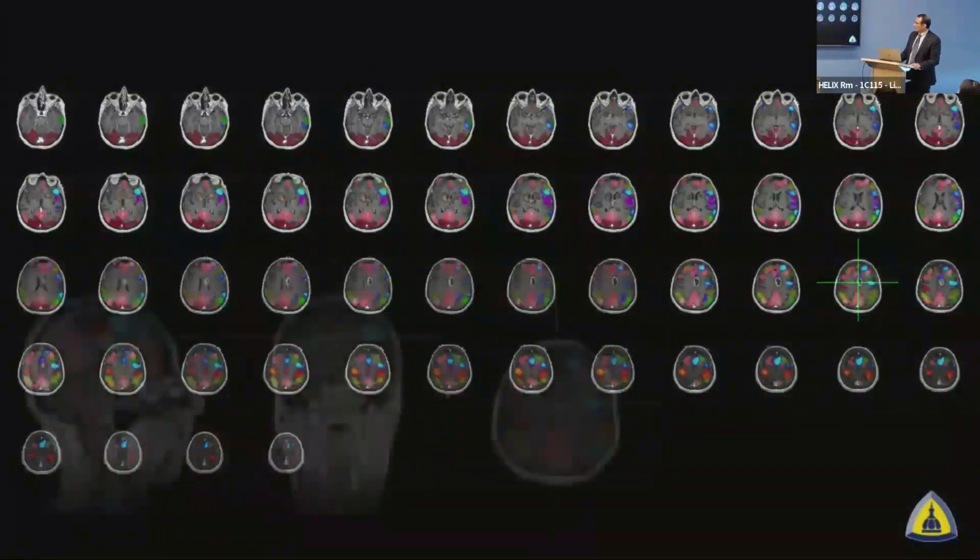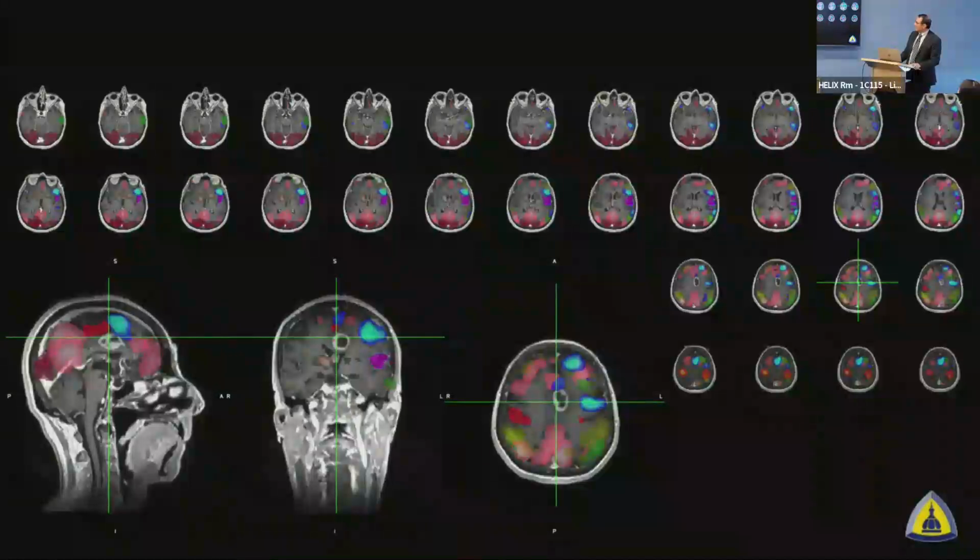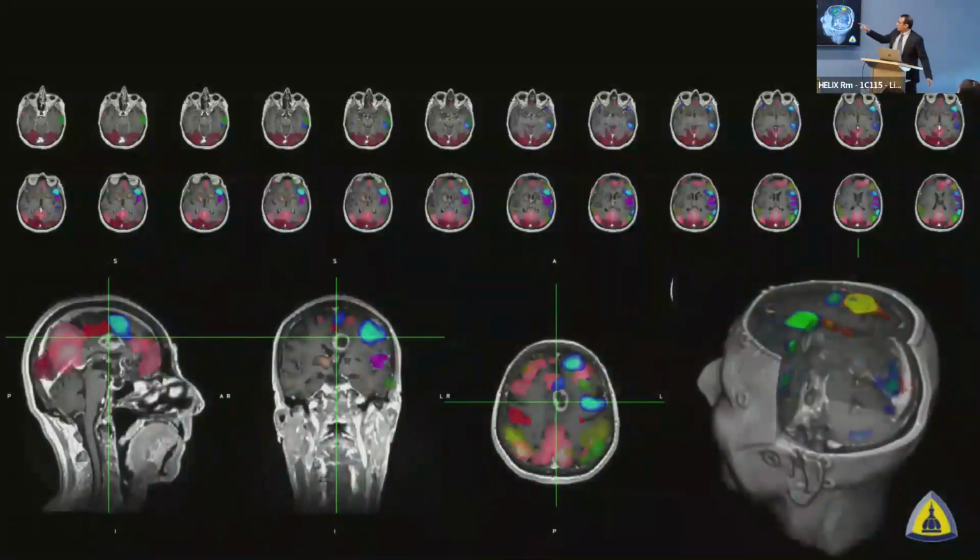And so I was able to generate these maps and then provide them to the neurosurgeon. So this is your supplementary motor area, pre-supplementary motor area. And I was able to provide a trajectory that's not really shown well over here, but in a real-time kind of evaluation with the neurosurgeon, a trajectory that would avoid all of the visible networks to get to the lesion safely. And the patient did extremely well. And then the surgeon was super happy about this.